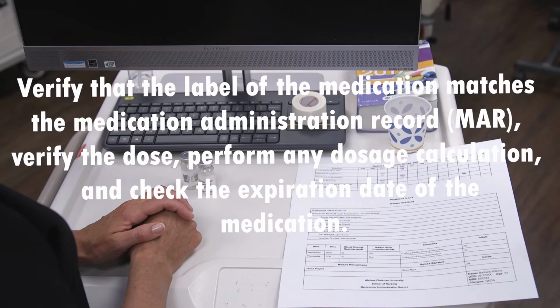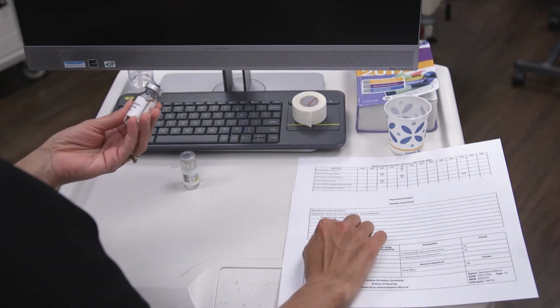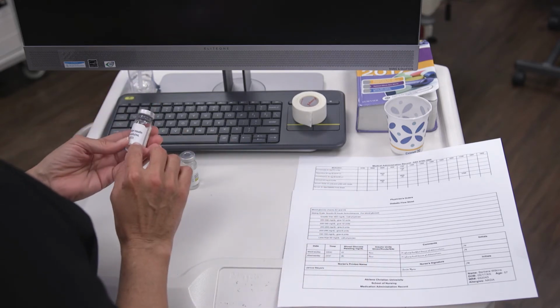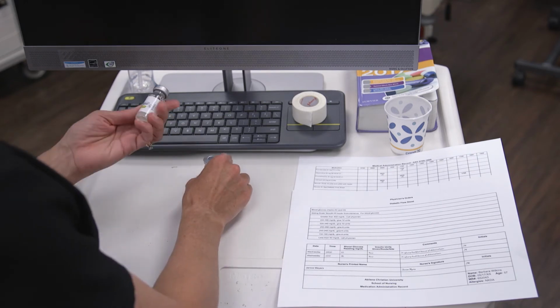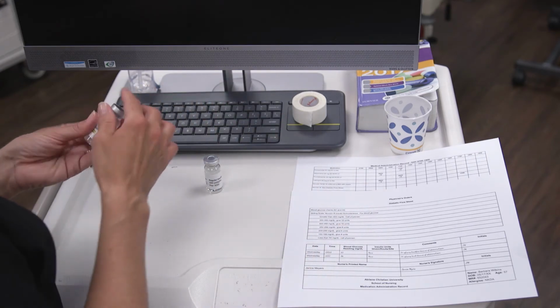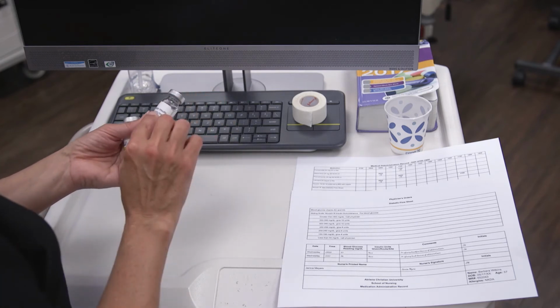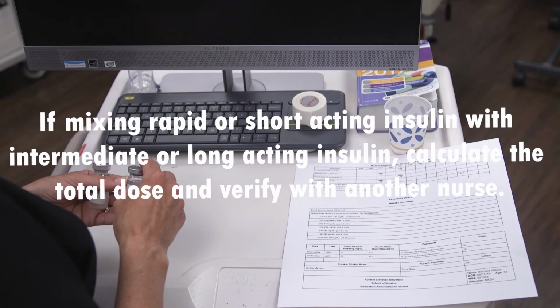Verify that the label of the medication matches the medication administration record, MAR. Verify the dose, perform any dosage calculation, and check the expiration date of the medication. If mixing rapid or short-acting insulin with intermediate or long-acting insulin, calculate the total dose and verify with another nurse.